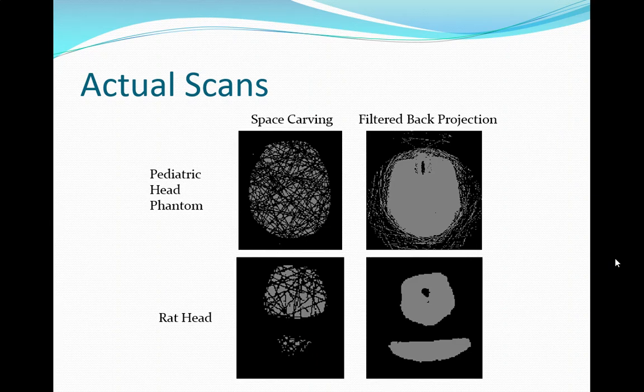Have we got an idea why that might happen? Remember those nuclear interactions that were rare? Because it's going super fast and not interacting with anything, it's going super fast and it hits something. And it generates a secondary proton with a lot of energy that's going in the same line. That one gets detected, but since the nuclear interaction propelled that secondary with as much energy as the primary or more, it looks like it didn't lose energy, and there's a chance it's just in line. There's not very many of these, right? You can count them up. It was like under 10,000. That's what clued us in. We went, I bet those are the nuclear interactions, and it turned out it was.